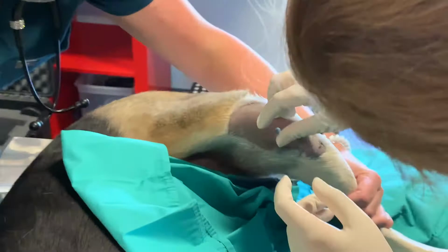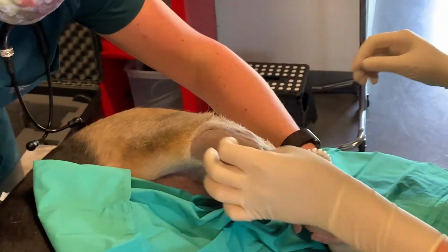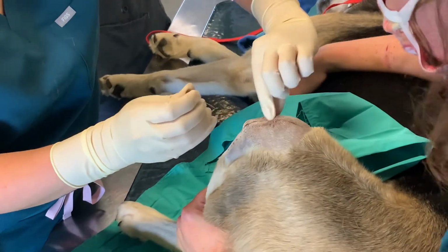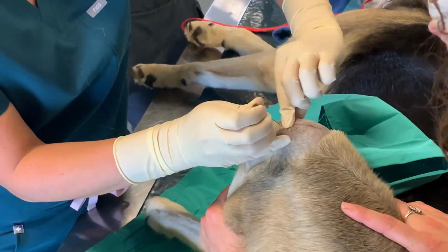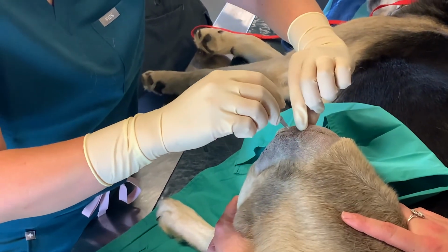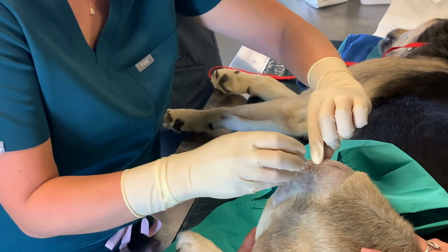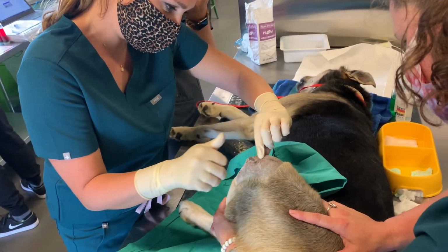Doesn't have a lot of fluid. I'm definitely in. Don't have a good spot, Garrett. Sorry. No, you're fine. She's got to get that needle in there. You might could come over here too. Yeah. You may have some scar tissue in there. It's pretty hard to get a... Yeah, that's what I'm worried about.